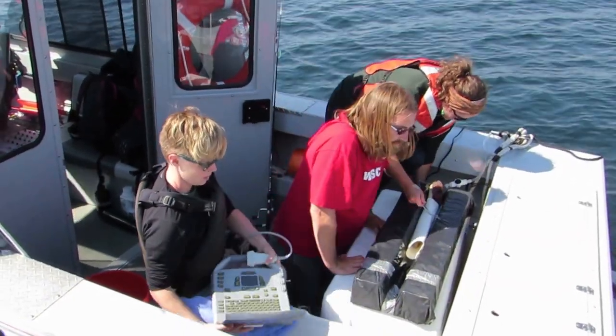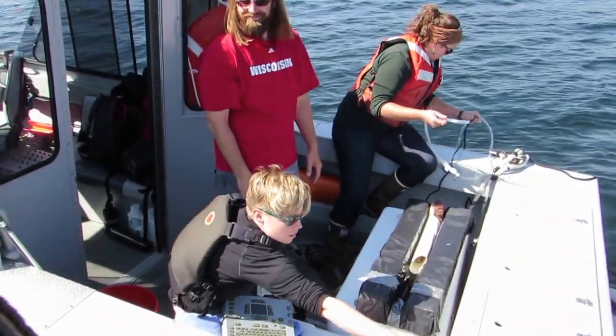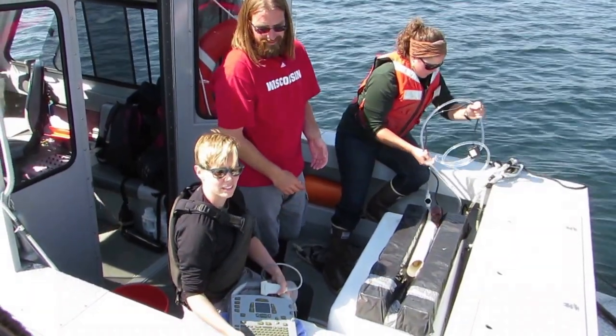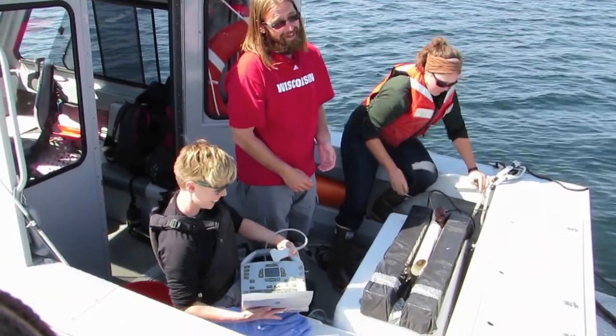We just watch them and they recover usually in about 30 to 40 seconds. It was a white male though, not an immature, so that's better — very good. Yeah, because we've had a lot of immatures.